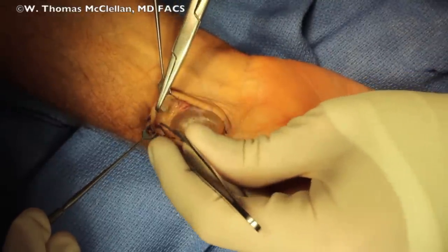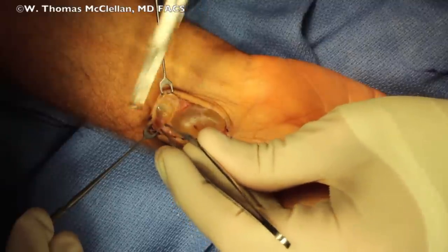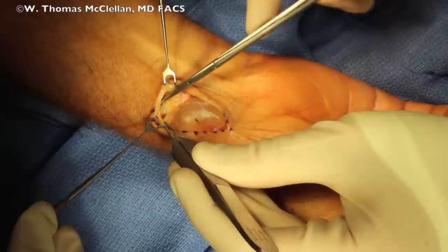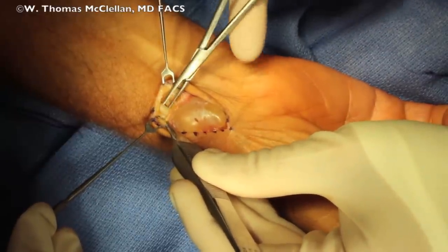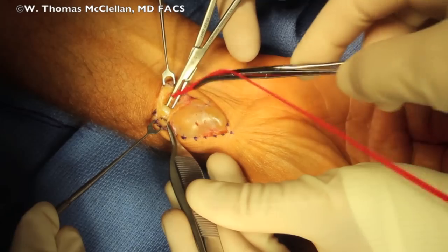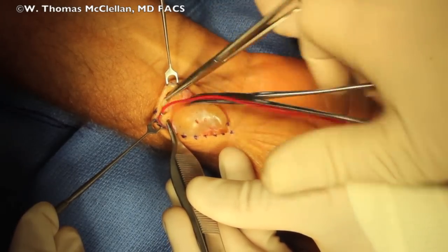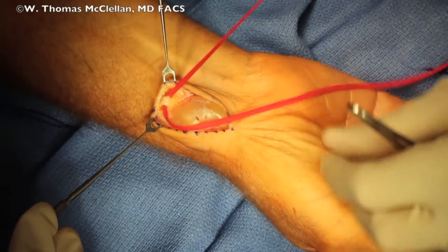Using a right angle, you can see the radial artery is the blue structure. I go behind the radial artery in the vena comitans and I pass a vessel loop, which will help with identification as well as traction as I dissect the ganglion cyst distally.